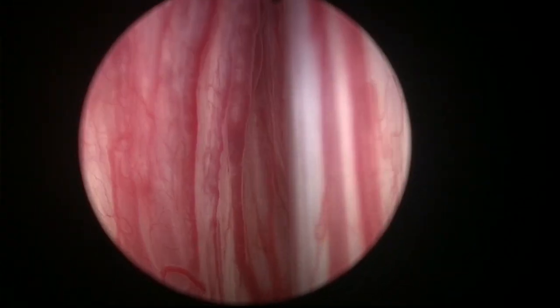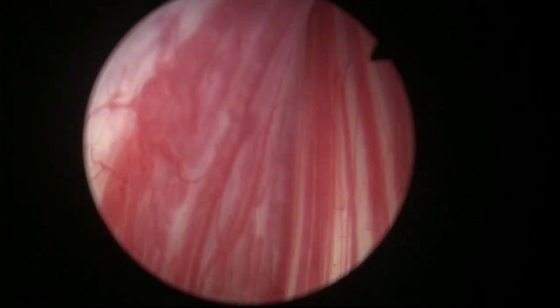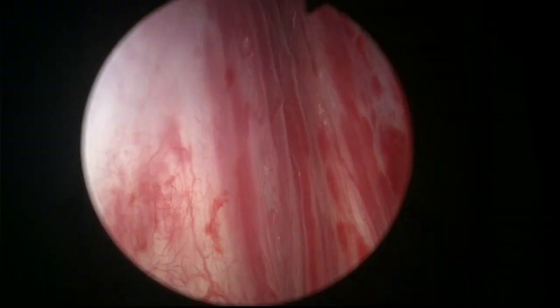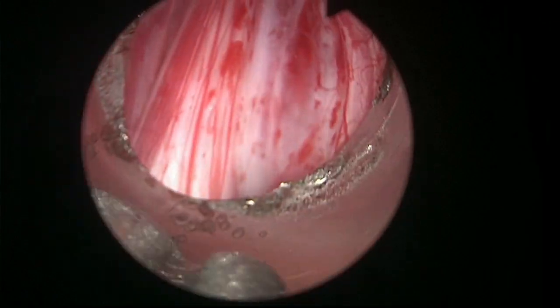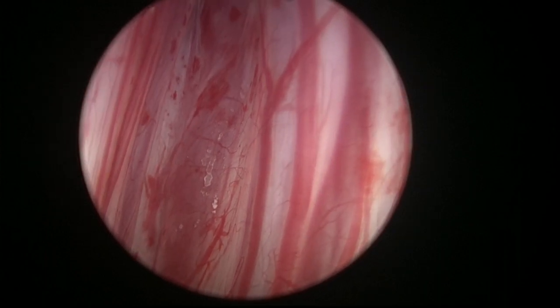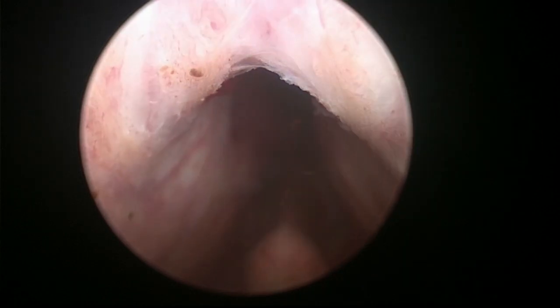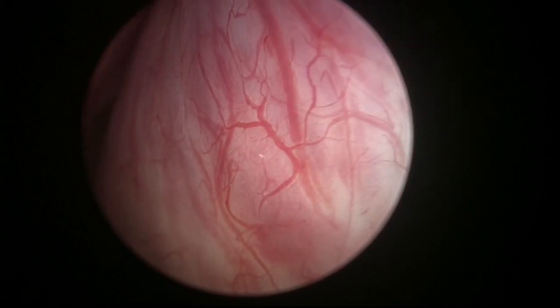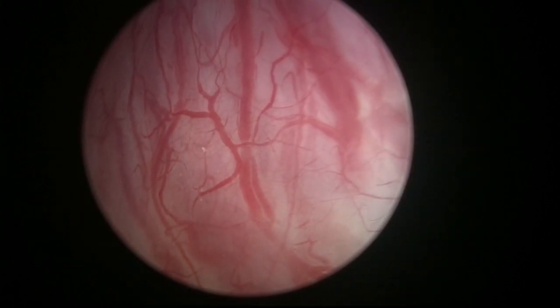Ok, so here we are. Another case. This is a very large prostate, in a man who has not had any complication, just bothersome symptoms. I don't want to force the entry into the bladder because if I do that, I will probably split the sphincter in the midline. You see, when you force too much, it was already starting to split. So I'd rather start the enucleation and then have a look at the bladder at the end.